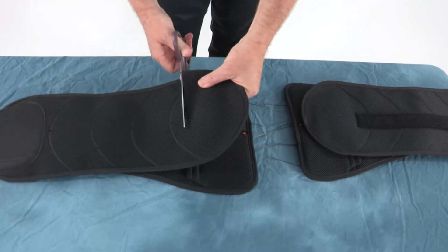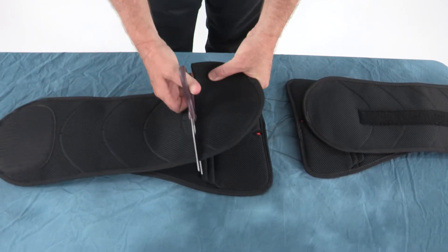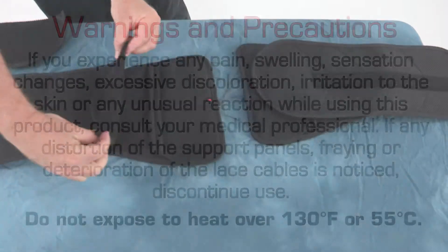Excess material on the belt wings may be trimmed. However, make sure the belt is properly fit prior to trimming.